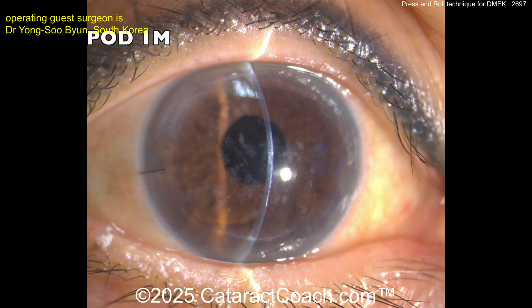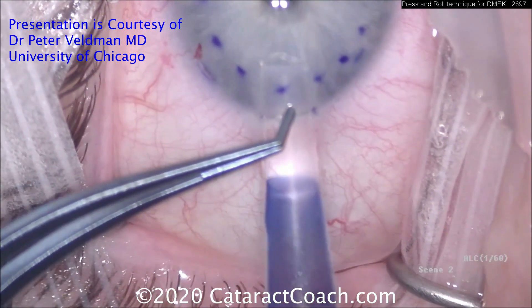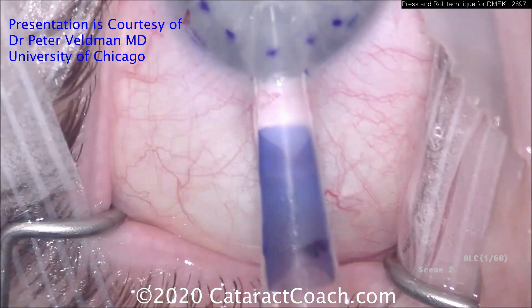Post-op day one looks great and post-op month one looks even better. For those learning DMEK, a previously made video (number 615) courtesy of Dr. Peter Veldman — a true expert — is referenced and replayed for further learning.